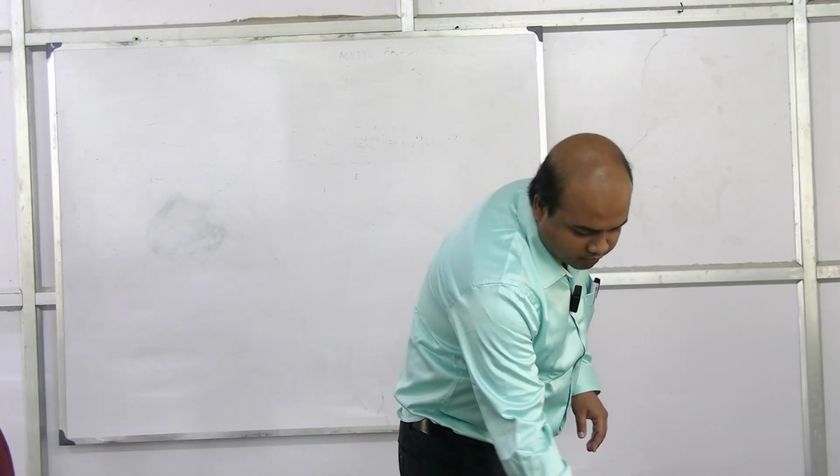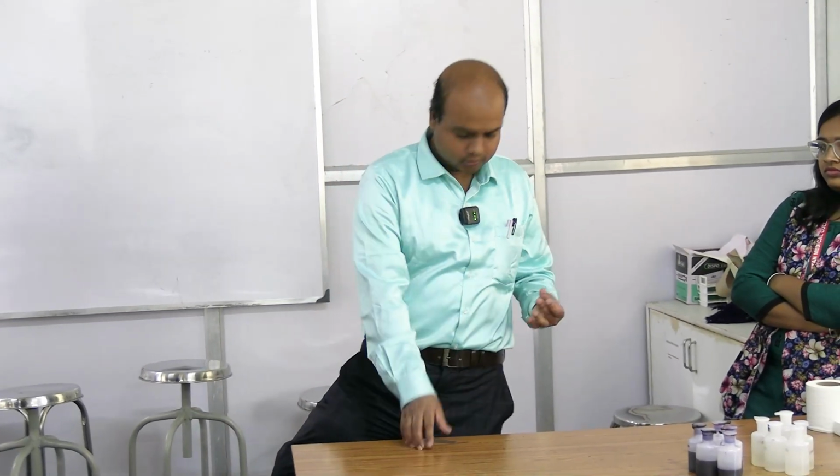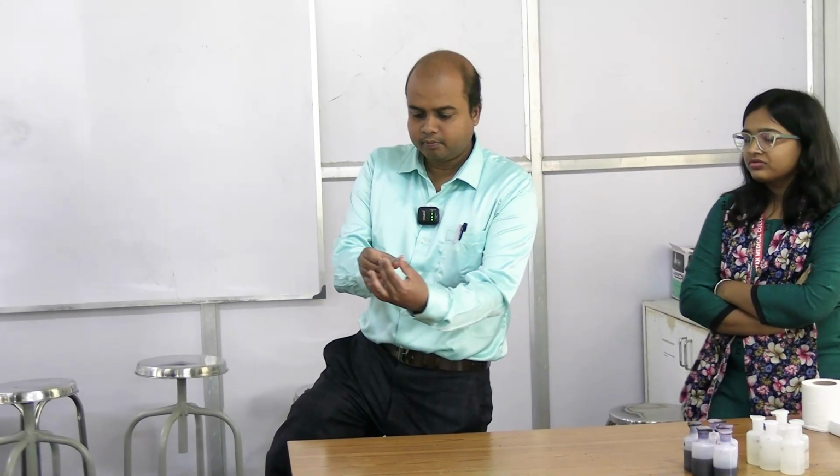So after you get the blood, for beginners I will suggest, keep the slide on a horizontal surface, or you will be provided with those. For just making the smear, keep it on any horizontal surface, on your working table. For the beginners, don't keep it in your hand, you will face difficulties. You can do it once you become experts, you can do many things.